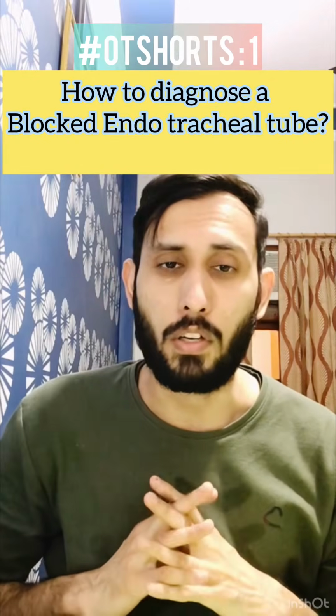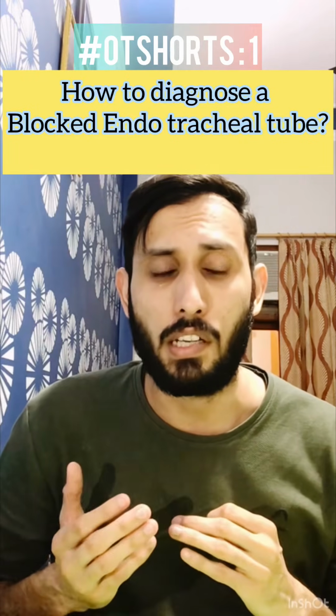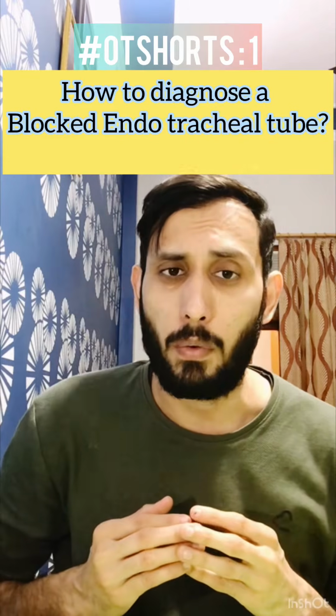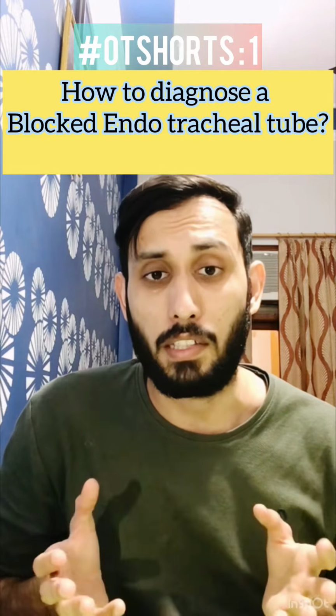Let's talk about the blocked tube scenarios. Now, obviously, before thinking about the scenarios, you should know when there's a high chance of the tube getting blocked. If the tube has just been inserted by you and you know the adequate depth of the tube inserted, why would you even think that the tube has got blocked?